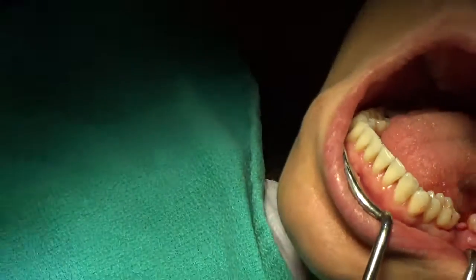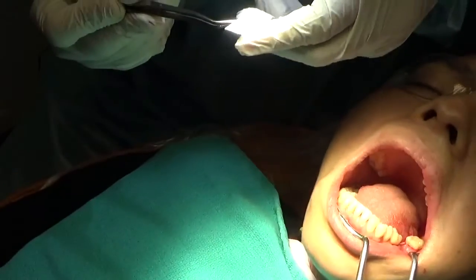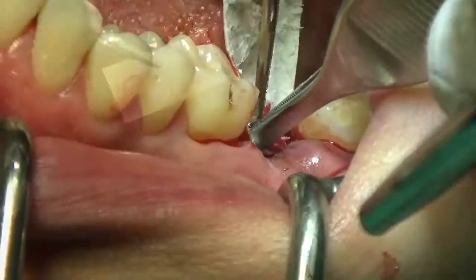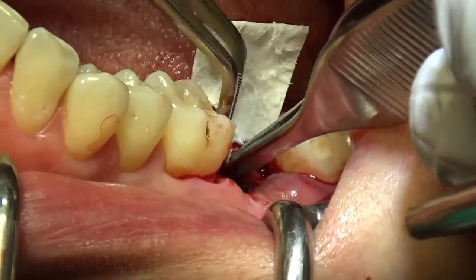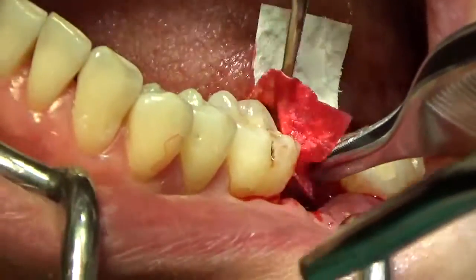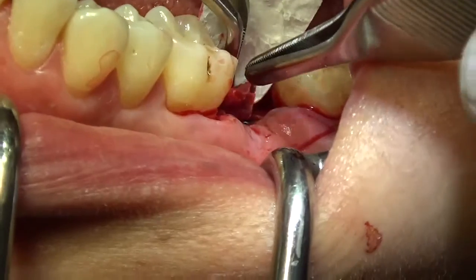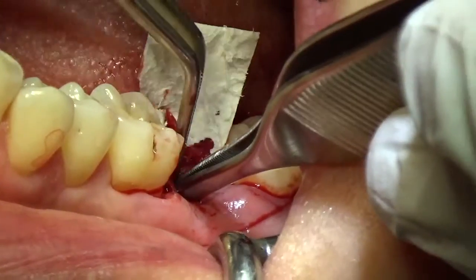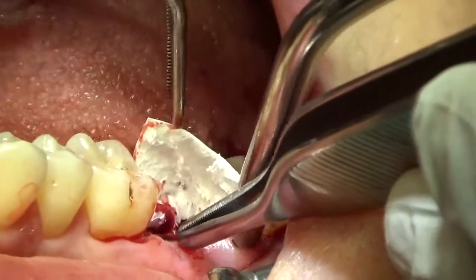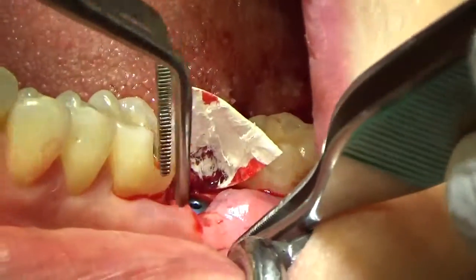So I was telling Jimena before, these BioGuides say up on the part that should be up. You can read it, and if you can zoom in on that, it says up, right, pretty good. The biggest issue I tend to have is they get sticky as soon as they touch blood. They tend to get very sticky and they're hard to manipulate. So now that BioGuide membrane is tucked into that palatal or that lingual pouch we've got.